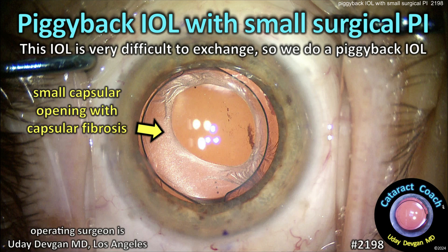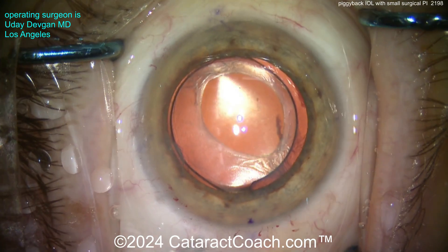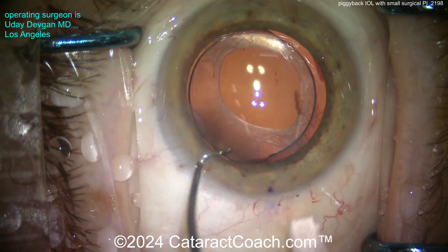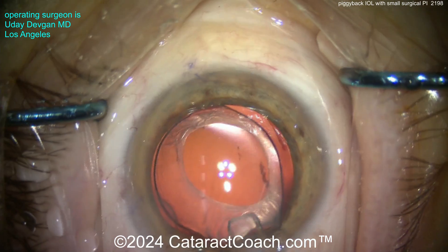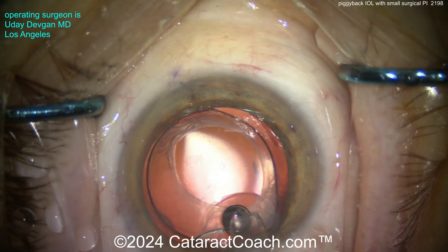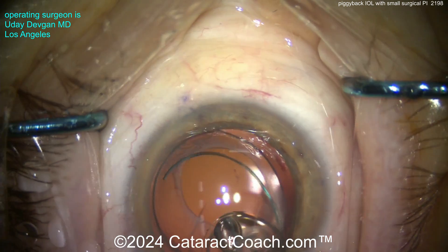From cataractcoach.com: this is a piggyback IOL case in an eye with a small surgical peripheral iridotomy. This IOL is very difficult to exchange, so we're going to do a piggyback instead. Here's the original surgery done elsewhere by different surgeons. You can see a very odd-looking, irregular capsule with a lot of capsular bag fibrosis. When I tried to dissect that lens out, it was just stuck, and I didn't want to cause damage to the capsular bag or zonular support, so we're going with a piggyback lens. This patient has an IOL power that's insufficiently low for this case.